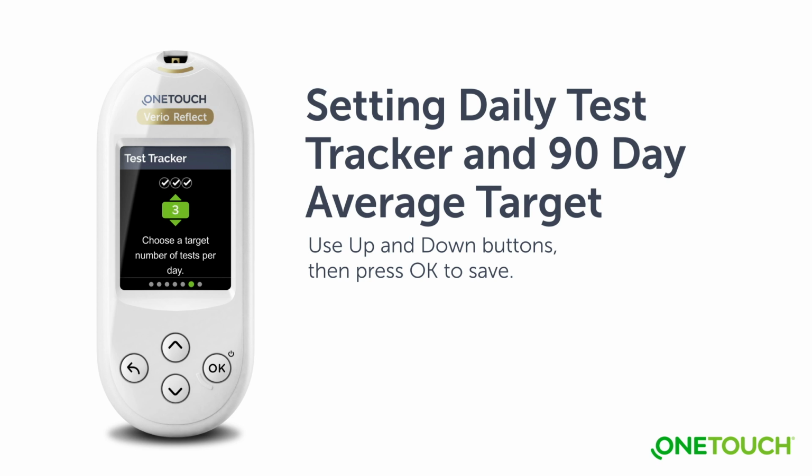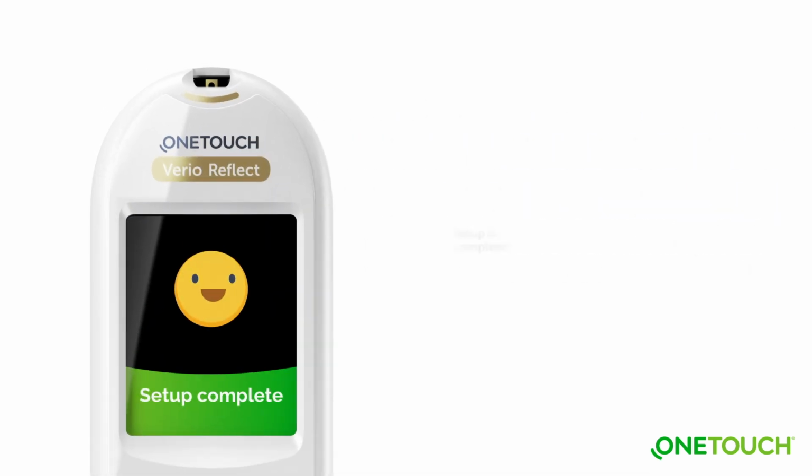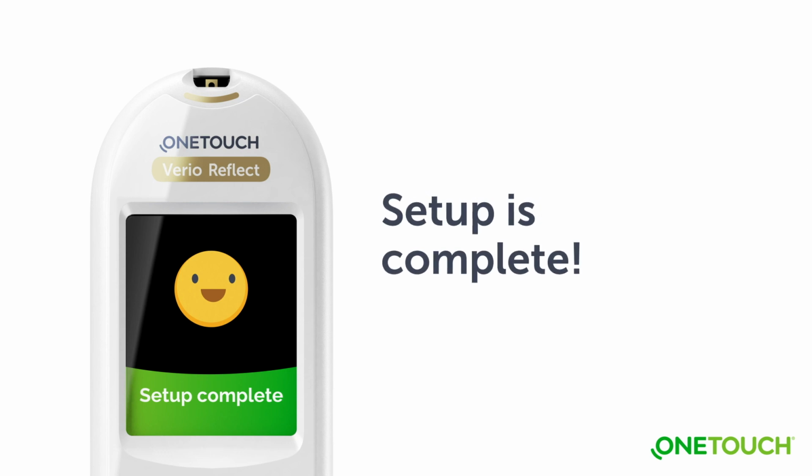The meter averages results over the past 90 days to provide a view of the overall trend of blood glucose results. Trend 90 lets you set your blood glucose 90-day average target and tracks progress towards that goal. Talk to your healthcare professional to determine the 90-day average target that is right for you. When setting daily test goals and 90-day average target, use the up and down buttons to confirm or edit preset data and press OK to save. Well done! Setup is now complete and your meter is ready for use.